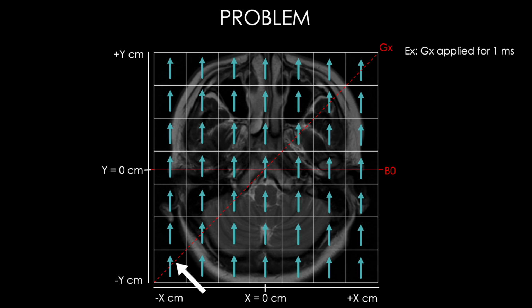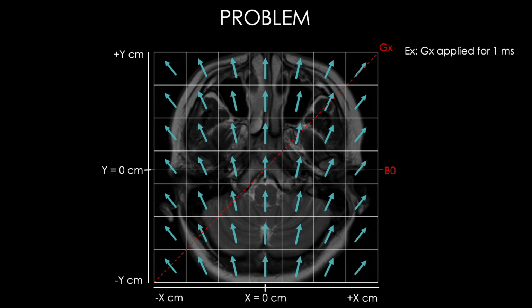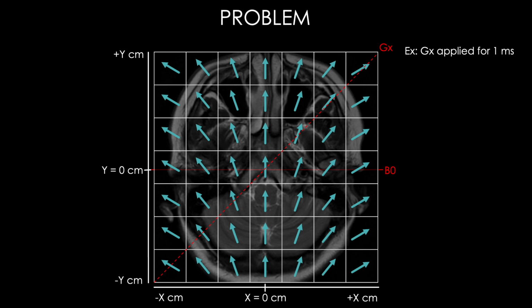Given this changes our magnetic field from low to high as we move from left to right across the slice, the little magnets we've created within our voxels will therefore rotate at different speeds according to our Larmor frequency, from slow to fast, moving from left to right, following the direction of our gradient field. This will therefore cause dephasing as shown. And as we know, the less in phase these magnets are, the less signal we generate.